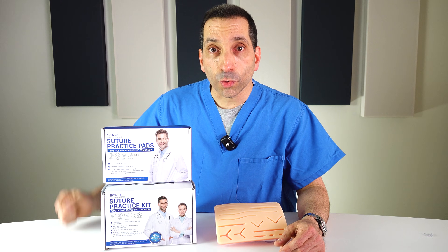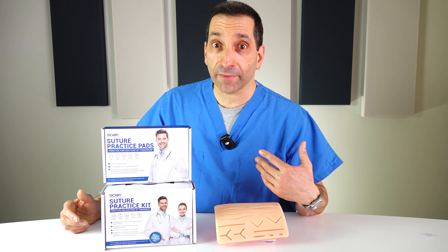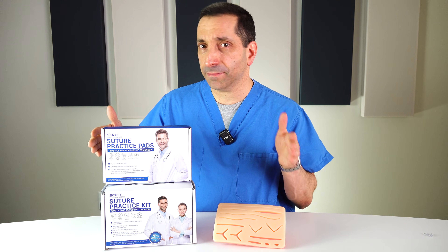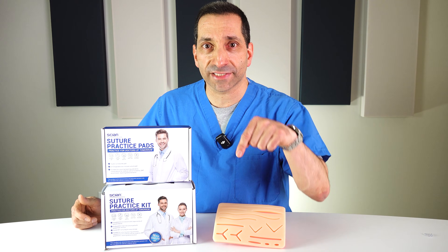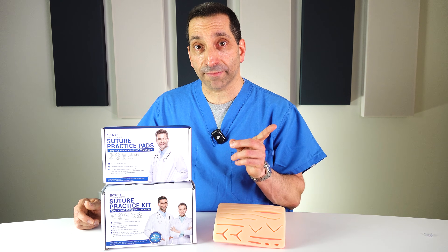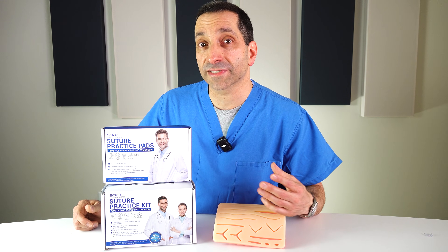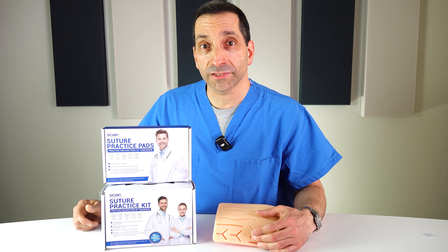There you go — the Sian wound care practice pads. These are a great option for many different situations where you want to learn and practice suturing. Even my local college's undergrad pre-PA club uses pads like this for practice suturing, so even if you're not in MD, PA, or NP school right now, these are great for many situations. I'll put links down below. As long as you're here, I'd love for you to watch some of my other wound care videos — I have videos on lots of different suturing techniques and tips on common mistakes people make when doing wounds. I appreciate you watching — catch you next time.